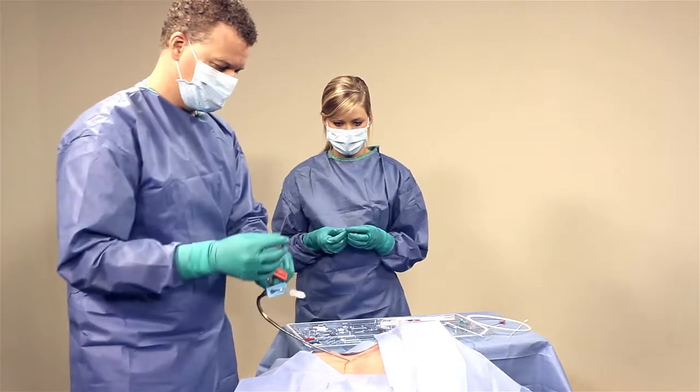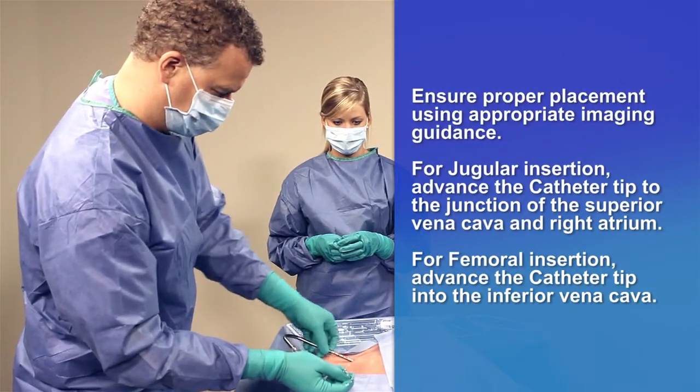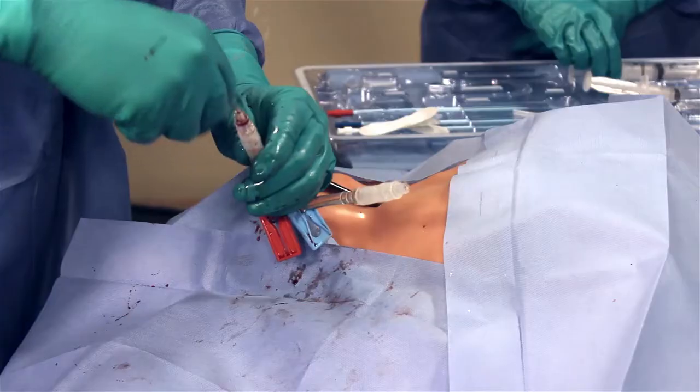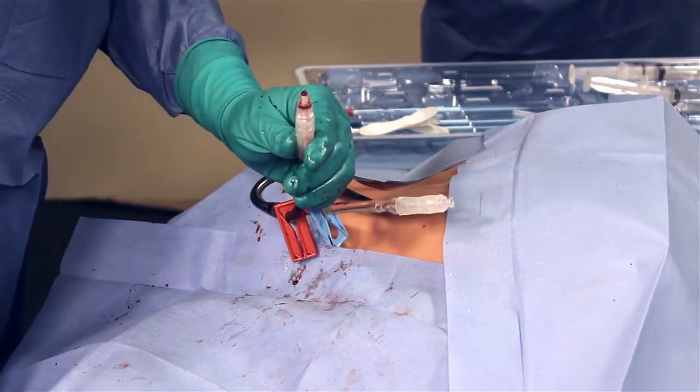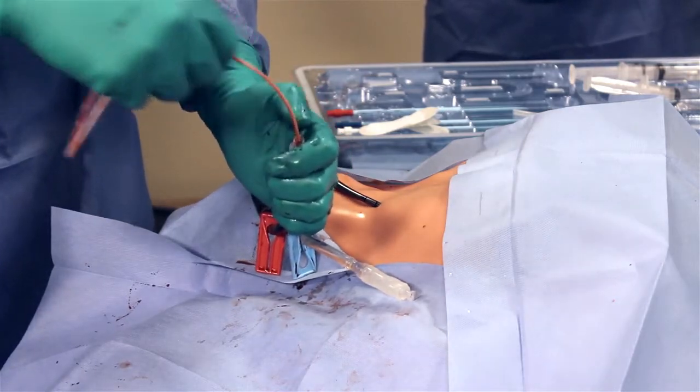Insert the catheter by feeding the distal section of the stylet over the guide wire. Withdraw the guide wire from the stylet. Then, unscrew and remove the stylet from the priming adapter.